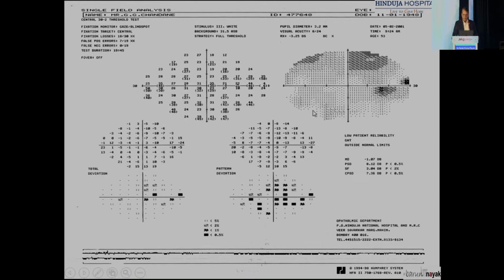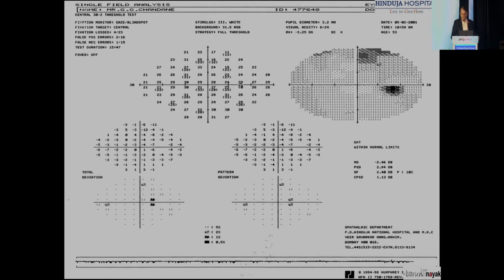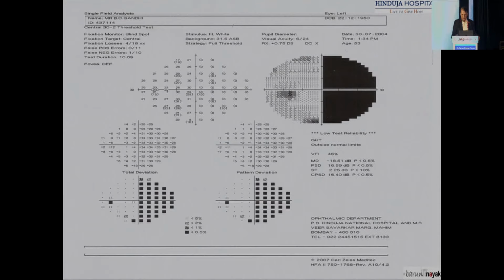Now this, I was talking about the white scotoma. Just gently look at this. The moment you look, you see white areas in the periphery, which no normal person can have that kind of sensitivity. If you read the numbers over here, it is around 45, 49, 50, which no human being, even in the central macular or foveal area, will have; sensitivity is not more than 39 or 40 decibels. If that is there, you can rest assured this test is not proper. When the test was repeated immediately after that, with the correct explanation to the patient, this was the response, where everything is normal.